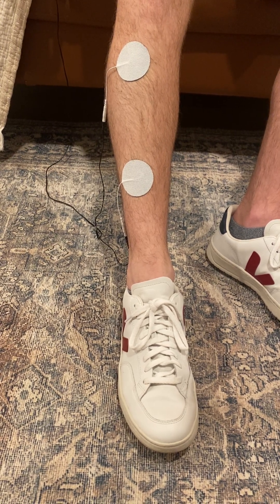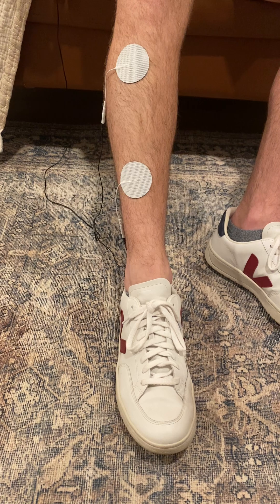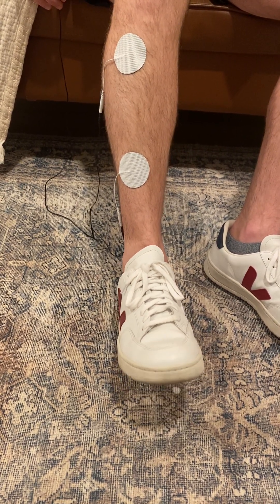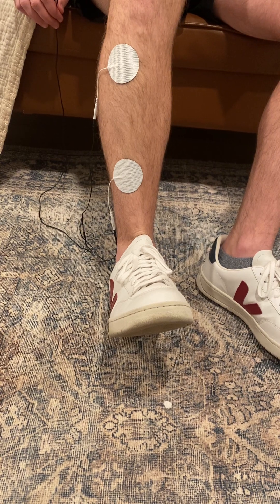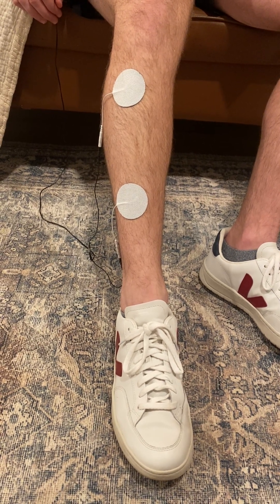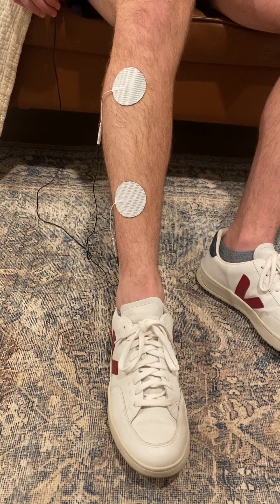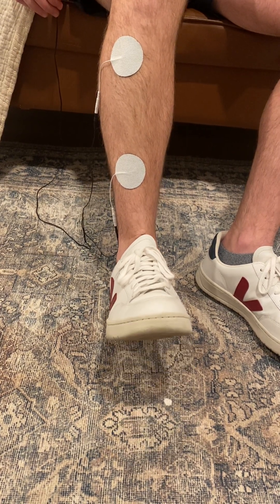I'm at 15 milliamps right now. My muscle is starting to twitch a little bit, but still not a strong enough contraction for my foot to start moving. You can see it start to come up a little bit — there we go, see my foot coming straight up. That is partial skill, partial luck that I got it right on the first try. This is not me moving my foot — I am not doing anything. This is purely the electrical current going from electrode pad to electrode pad over top of that muscle, causing my foot to come up like this.